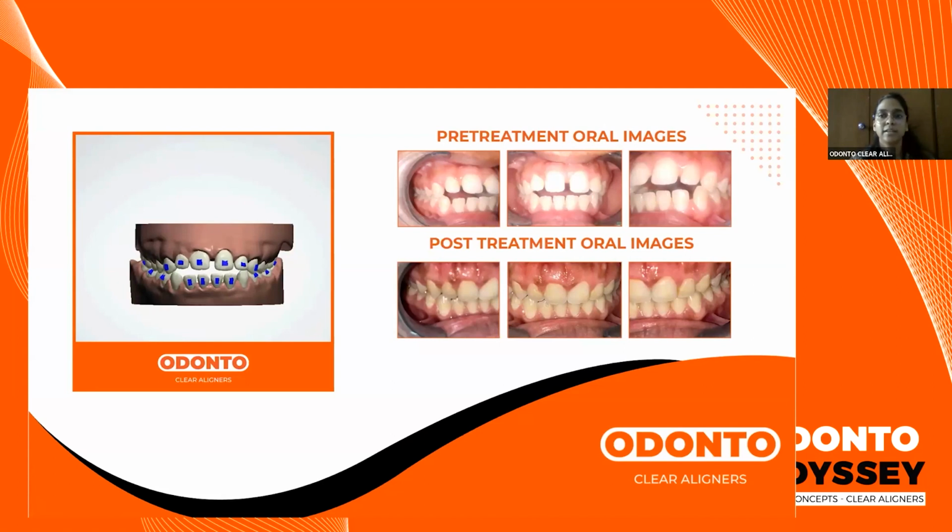You have to factor in and explain to the patient when they will see this, that we are trying to bring about a certain overcorrection. This is a concept which is not very easily understood by your patient, but to a certain extent, you need to be in a position where you make them aware of it. So that's something you need to keep in mind. So if you have a deep bite case that you send us, we will always show it as probably, we'll overcorrect and show what is possible.